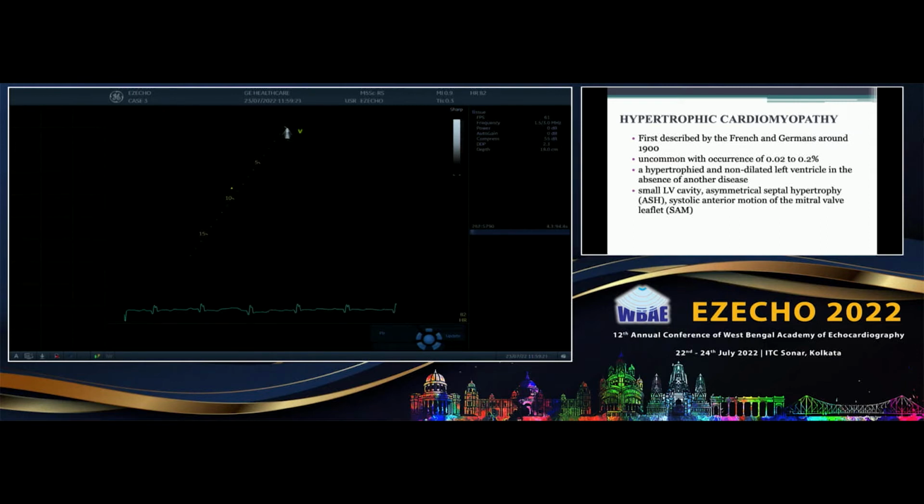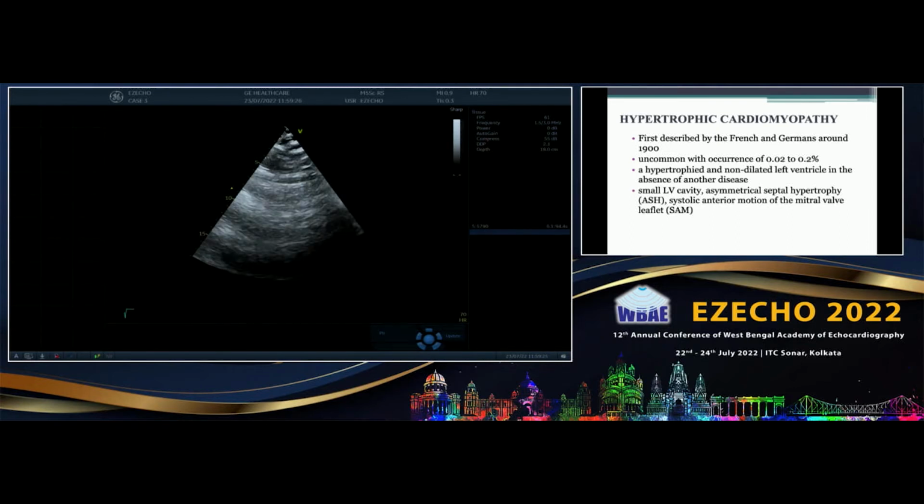And interestingly, when we measure it at 40 millimeters, the surgeon actually measures more than 7.5 centimeters diameter, because he actually gets septum to lateral wall dimensions, which we never get. So when we measure around 4 centimeters, the surgeon will be measuring it at 7 or 7.5 centimeters.